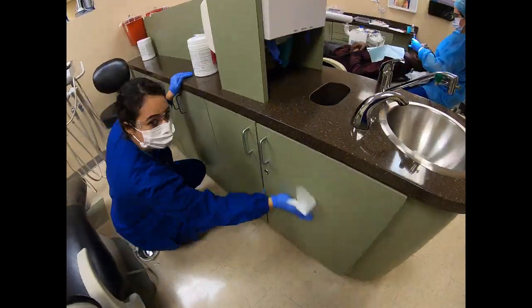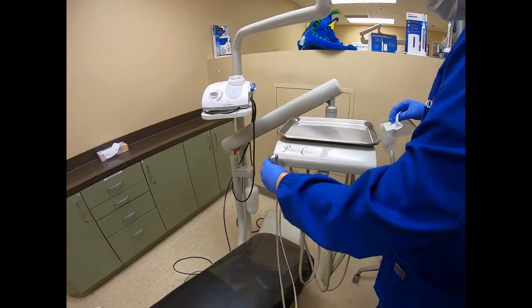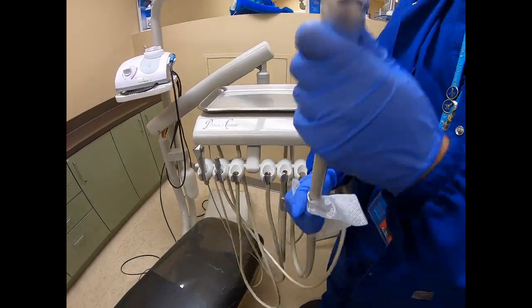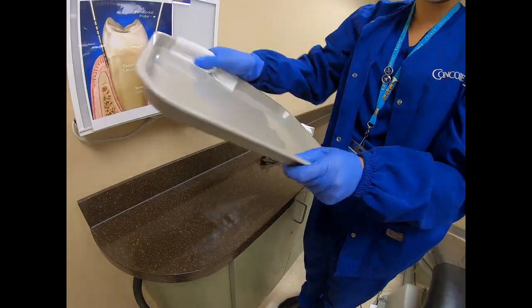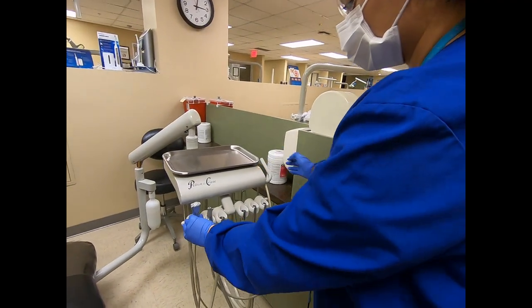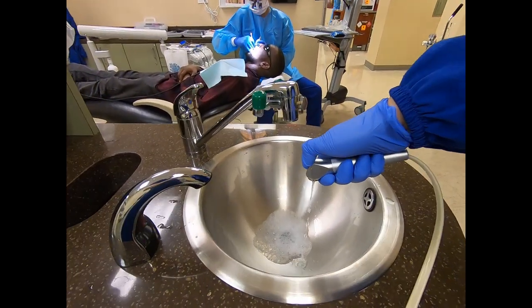Clean and disinfect the room along with any other compromised items such as the transport tray and Pro-EZ spray bottle using the exact same wipe technique used previously. Once the room is disinfected, you will need to flush the air water syringe and Cavitron if used for 30 seconds between patients.